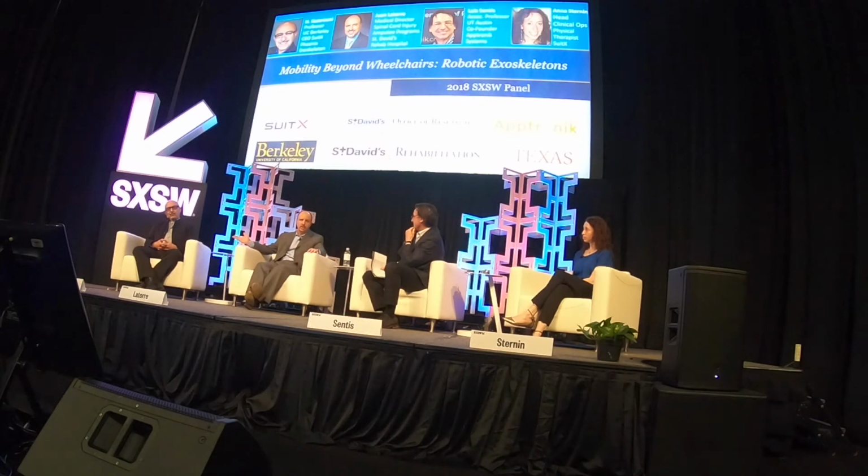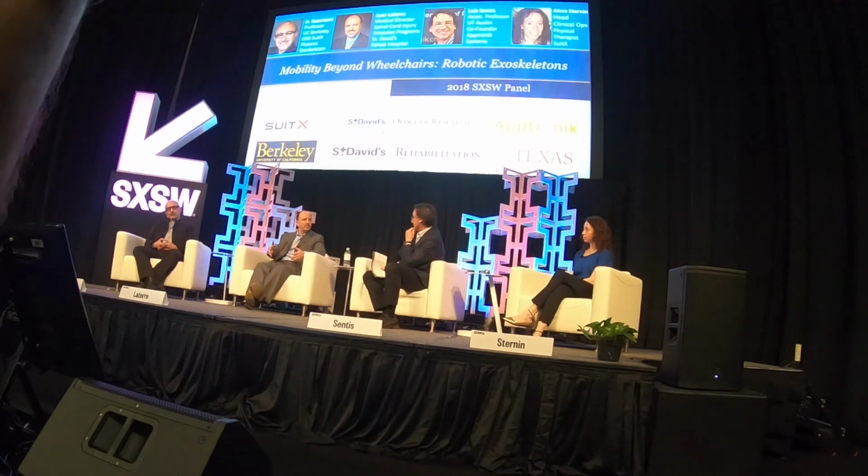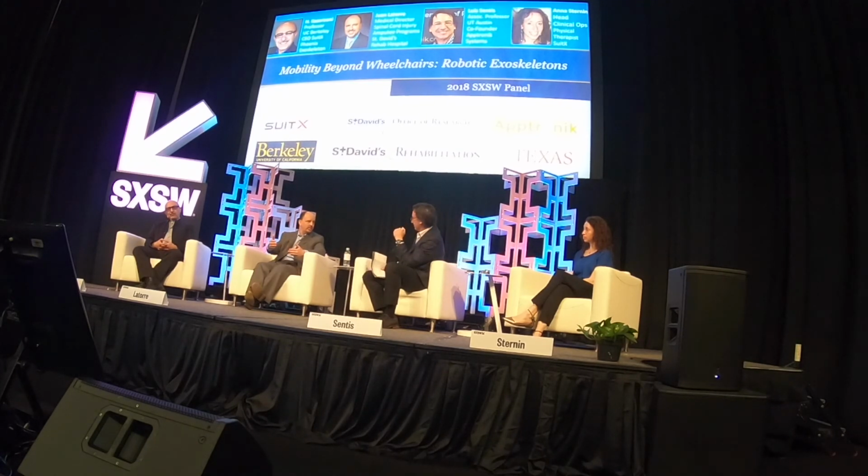The problem is, as Dr. Kazerooni mentioned, the more stuff you add to these devices, the more cost you're going to add to them. Of course. So I think eventually it'd be nice to see the prices come down also on functional stimulation, so you can combine both of them, because I think there's definitely a patient population that can benefit from both. Okay. And regarding EMG, electromyography, is that a sensory mode that can improve the transparency of these devices?